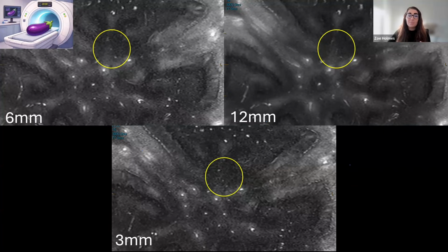So again, it's relaying everything back to: am I still going to solve the clinical question if I pull this lever? Classical volume traps include exiting nerve roots, small cord lesions, and things like drop mets, which can be hard to see. Subtle meniscal tears within the knee, small bone marrow lesions, and thin cortical lesions are also going to be missed if we increase our slice thickness too much and don't account for what we're looking for.